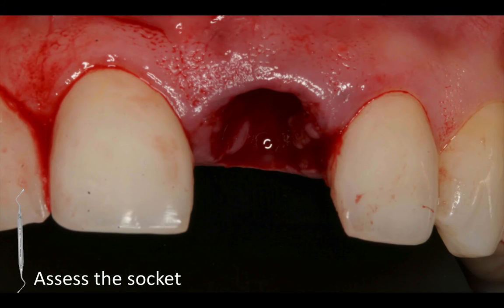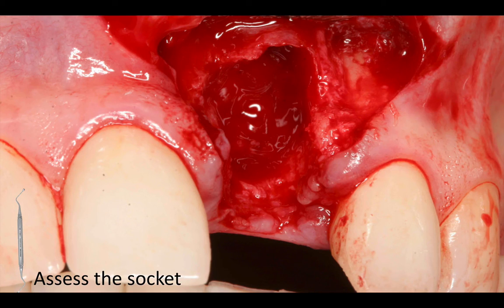So the next step is to assess the socket and debride it. Use some spoon curettes. And what you'll probably notice as you're debriding the socket is that on the buccal surface, you're only dealing with soft tissue. Now, because this infection is relatively large, I typically reflect a full thickness flap. And in this case, you're seeing that I use 2 vertical releasing incisions. I'm sparing the papilla. I wouldn't want to damage the papilla on the adjacent teeth. And I'm reflecting a flap in order to clean out the defect and have good access, but also in order for me to regenerate this defect and place a membrane beyond the margins of the defect.